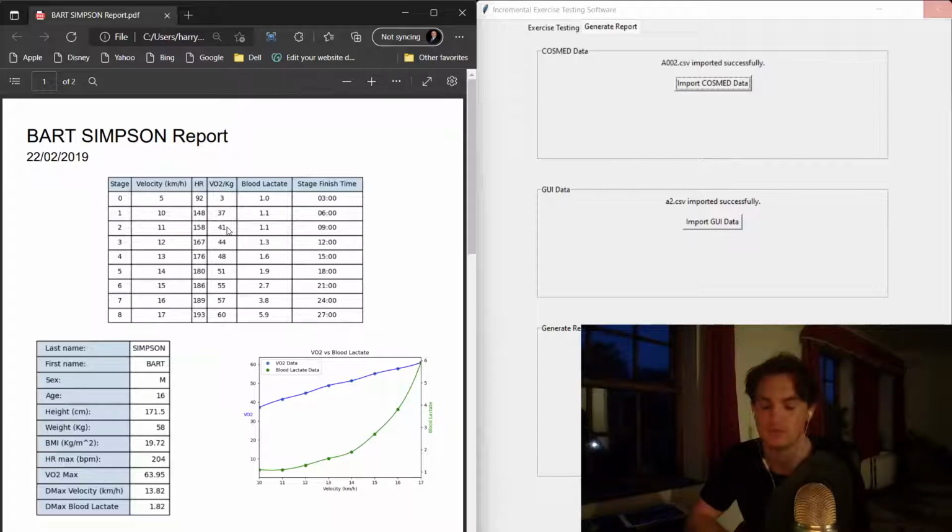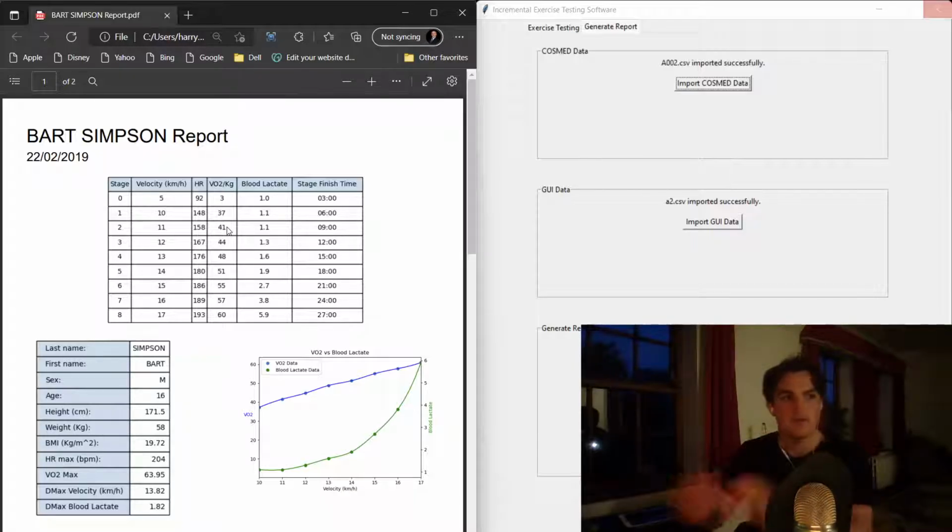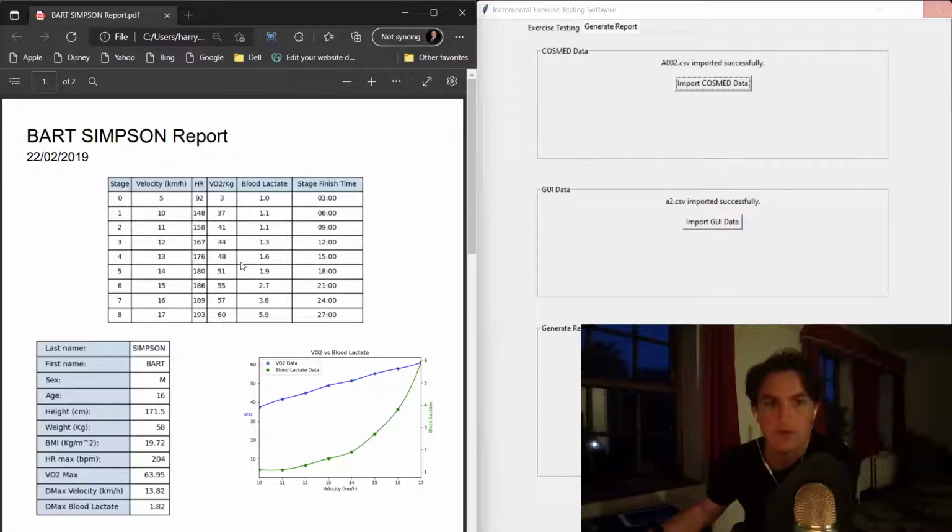It's a standardized data set, so he can use it to compare the control group against the study group, or to compare the progress of the control group from the start and the end of the study. So it's very useful.